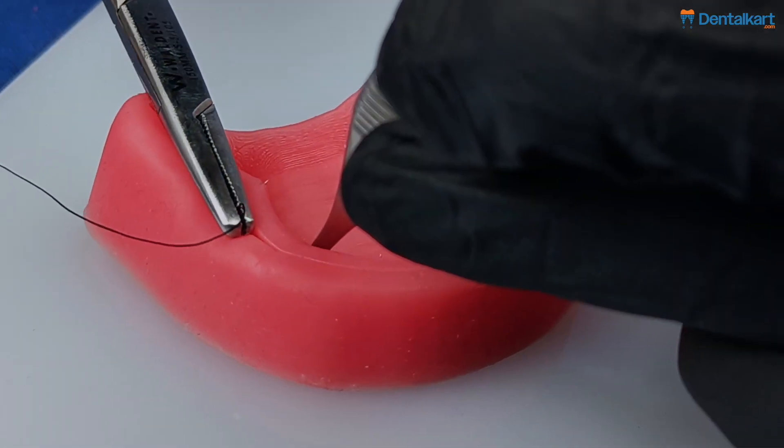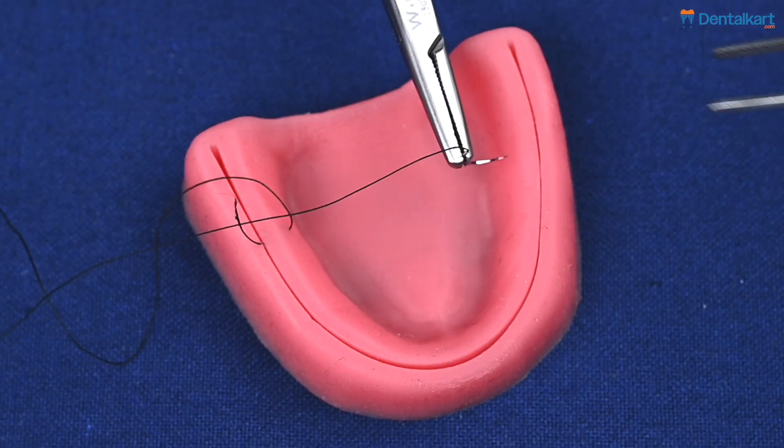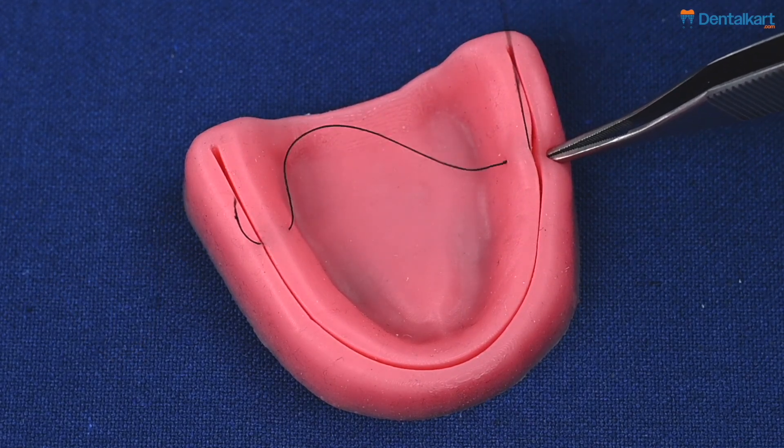We begin by passing the needle in the area of the premolars or molars of this demo model showing an edentulous maxillary arch.